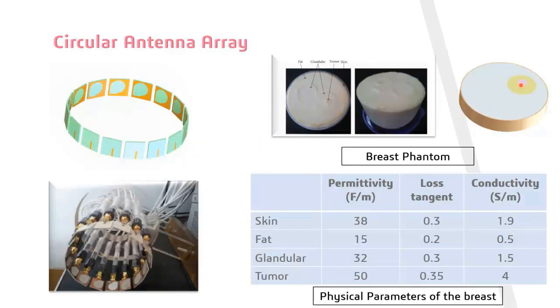Inside SOLIDWORKS, we will use this antenna element for circular array construction, and we will model the breast phantom to be placed inside the array. The breast phantom consists of a 2 mm thick layer of skin and 88 mm diameter of the breast, and a circular glandular in which the cancerous tumor is inserted.